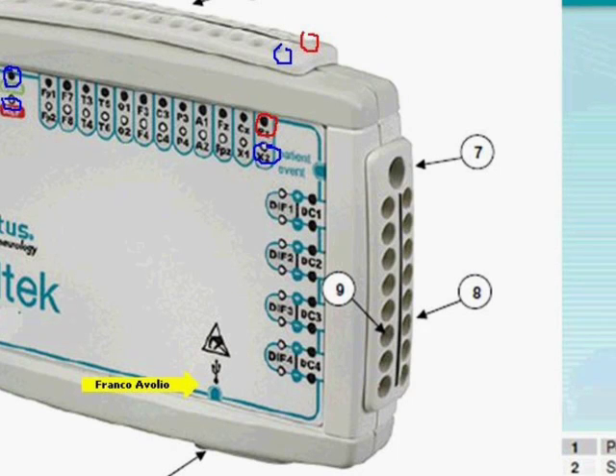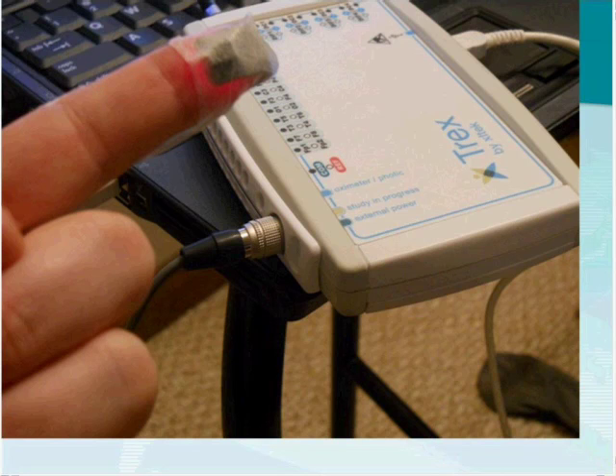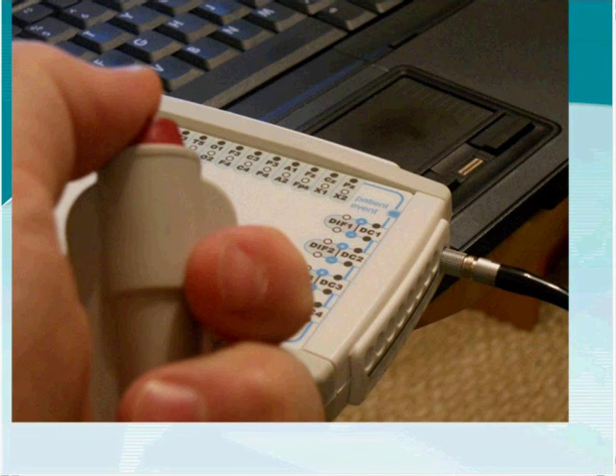There is a USB connection port on the unit. On the corner, there is an oximeter port where we use a Nonin oximeter accessory. The same port can also be used in EEG to connect a photic lamp. Some people use the Trex for routine EEG studies, even though it is not necessarily a recommended setup. There is also a patient event button input on the differential side, usable for both EEG and sleep.